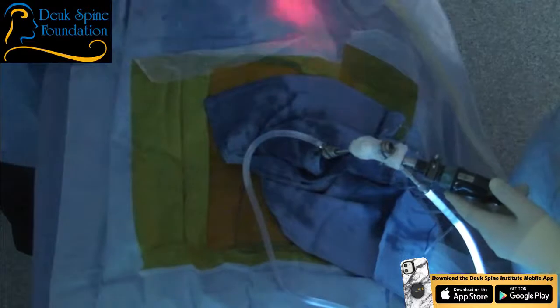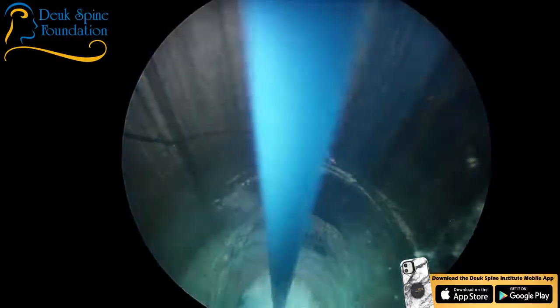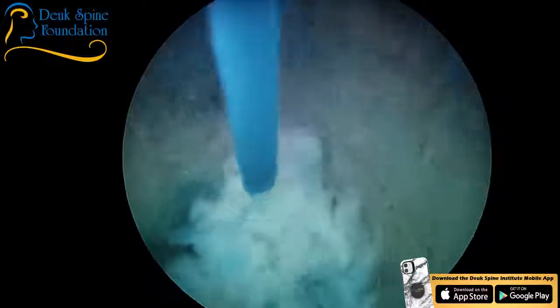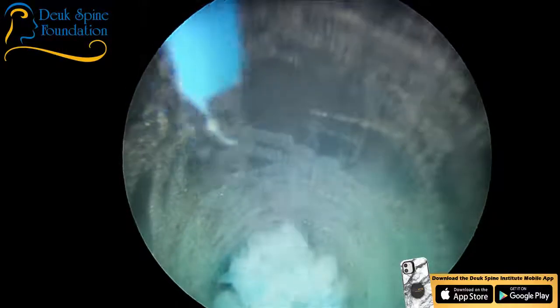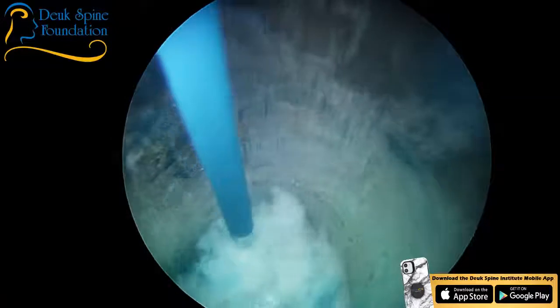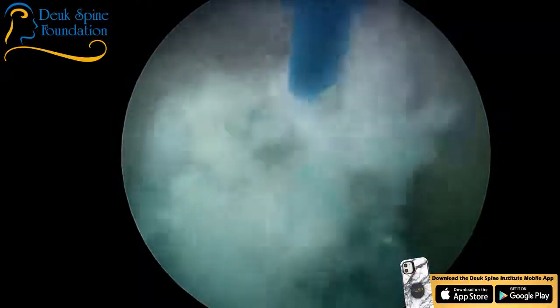Everything we do at Duke Spine Institute is 100% legal, FDA approved, vetted, and safe. A viewer asked: isn't it unsafe for the patient to be able to move while I'm in their back? The answer is yes, if the patient was wiggling around, it would be very unsafe. But that's why we use anesthesia — the patient is asleep right now, with an anesthesiologist monitoring blood pressure, vitals, and oxygenation.